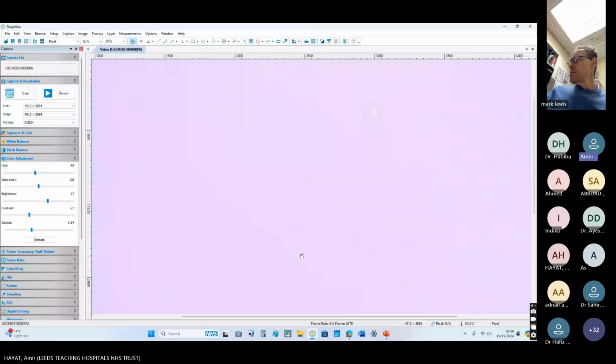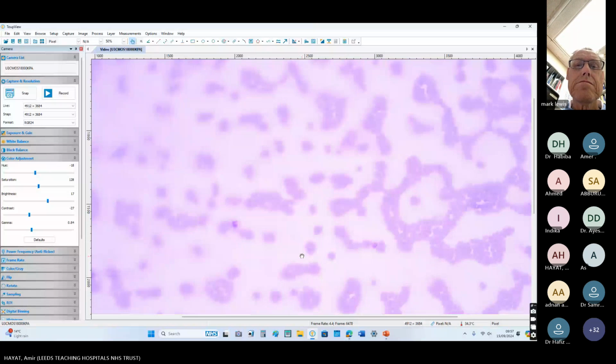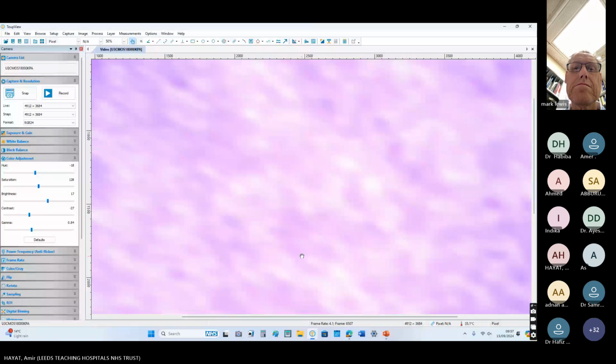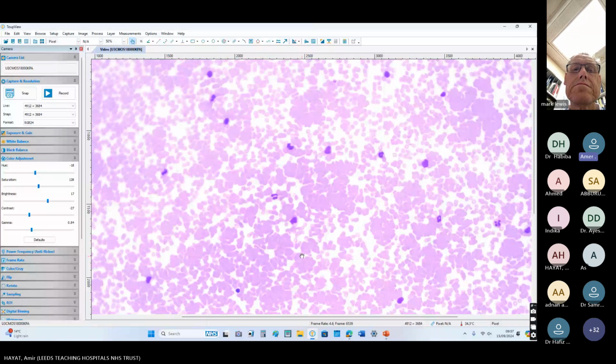Right. So now we have another 40-year-old lady who is coming to the emergency department with easy bruising and 2 episodes of epistaxis. So this is power 10. So this is again a young lady who is coming to ED with easy bruising and 2 episodes of epistaxis.